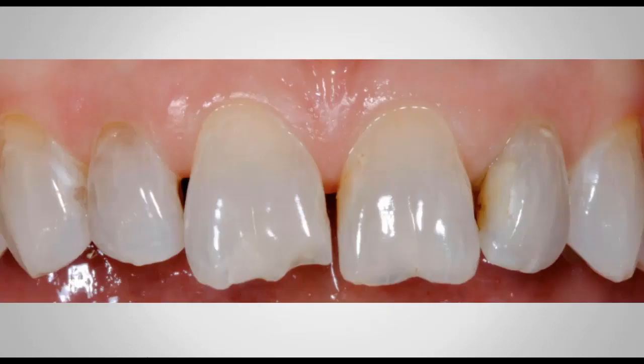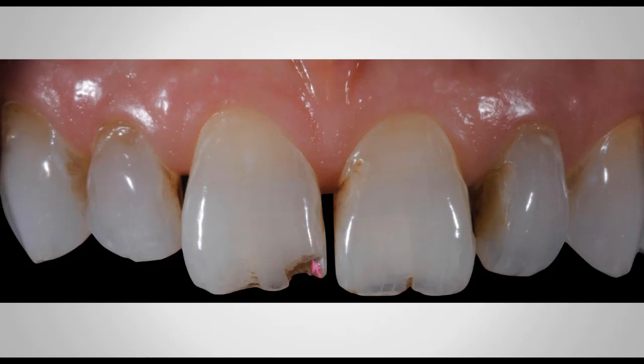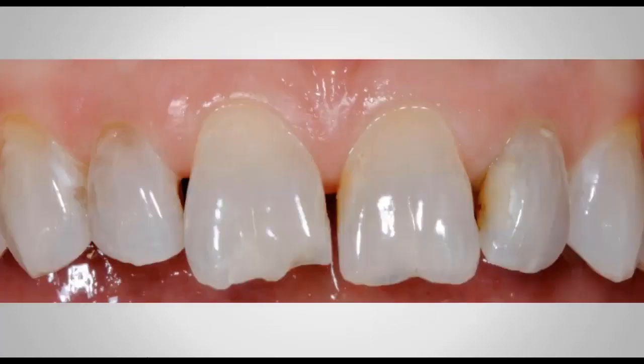But as you can see, I'm going to go to the previous one. Look at this. Look at the stains. Some areas of some staining and some unsupported enamel. All I did was remove a little bit of the staining and the unsupported enamel. So there's literally no preparation more than just eliminating that unsupported enamel and the stains, because I don't want the stains to show through my prototype. I want to enhance our smile.